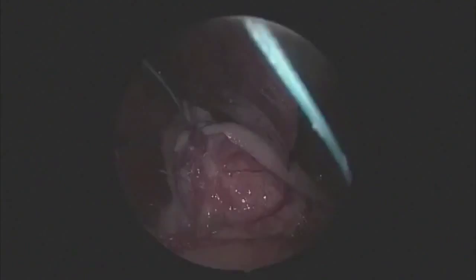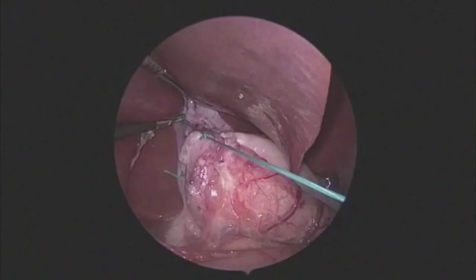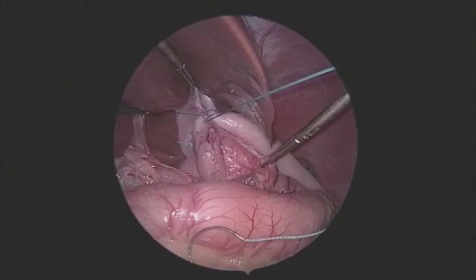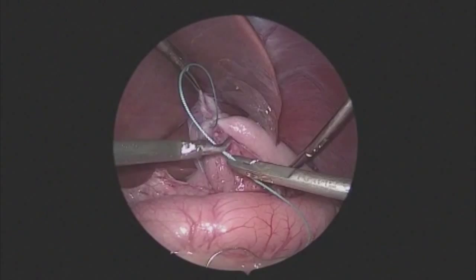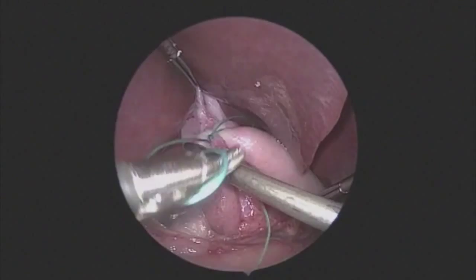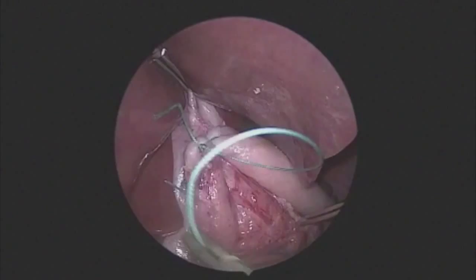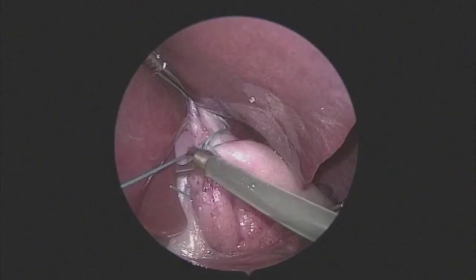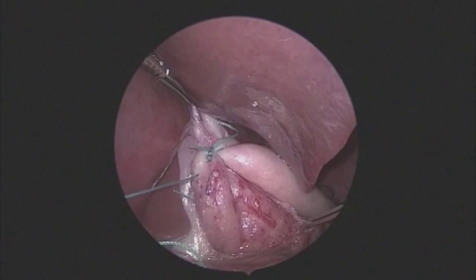The wrap is now set within the abdomen with the upper stitch in place. We use the left upper quadrant Babcock to pull the GE junction down and the fat pad out of the way, giving a clear view of the intra-abdominal esophagus to confirm all stitches are above the GE junction. One common mistake, especially with a minimal dissection technique, is that the wrap ends up too low on the GE junction — it is important to ensure stitches are not placed too low.